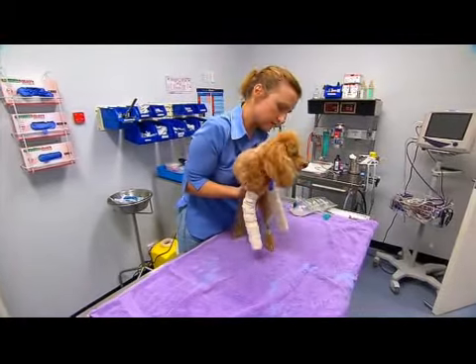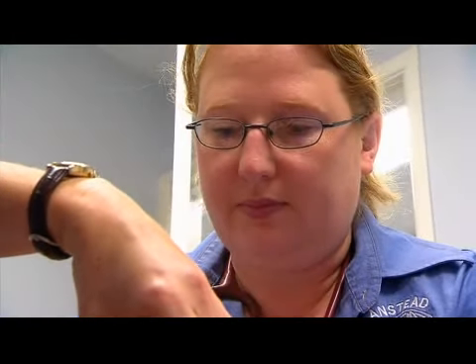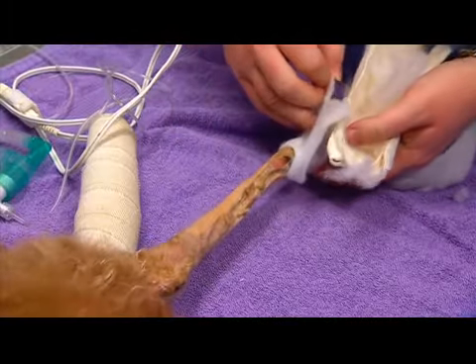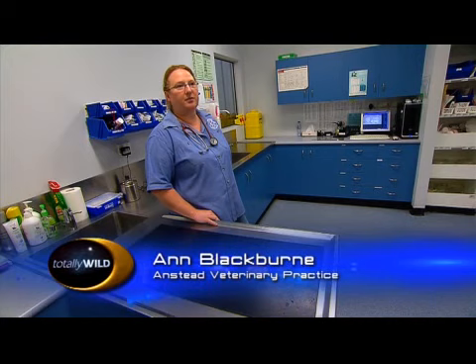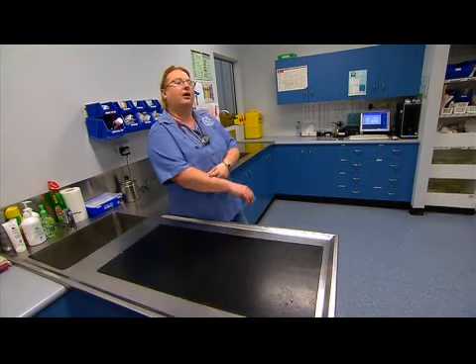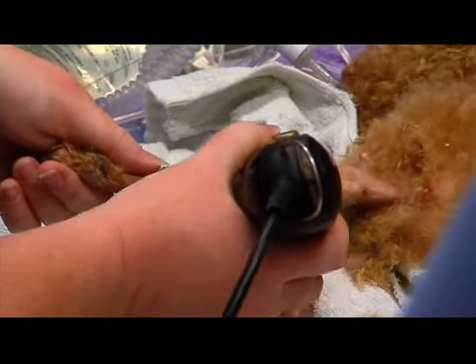The plan today is that Charlie will have some plates inserted in each of his front legs. Sometimes surgery doesn't go according to plan in that his legs are so tiny. His bones are literally 4 millimetres in diameter. So it may be that we have to change tact partway through, but the plan is to insert plates because he's broken both his front legs midway through his, what we would call his forearm. So plating is certainly the best option.